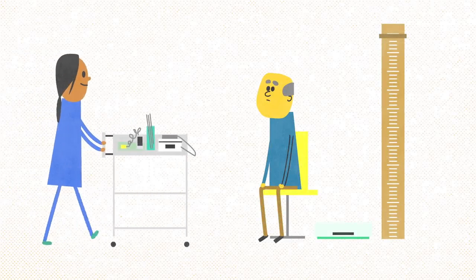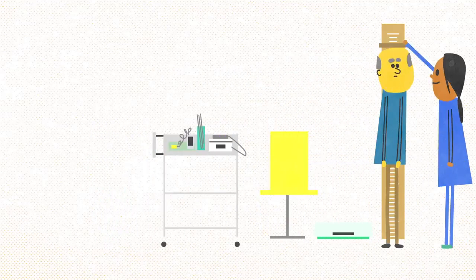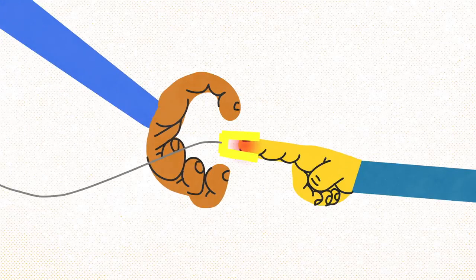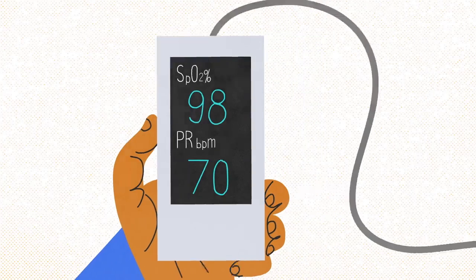It's an increasingly common sight in hospitals around the world. A nurse measures our height, weight, blood pressure, and attaches a glowing plastic clip to our finger. Suddenly, a digital screen reads out the oxygen level in our bloodstream. How did that happen? How can a plastic clip learn something about our blood without a blood sample?